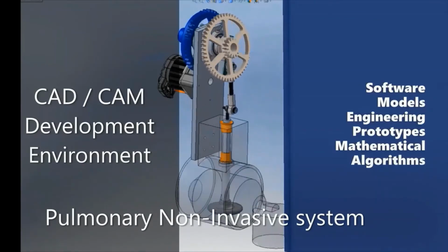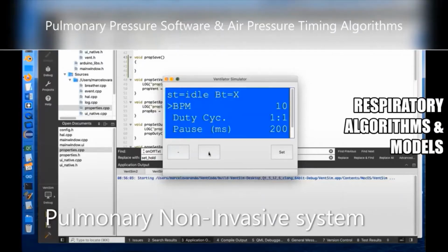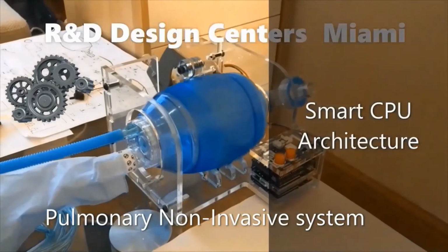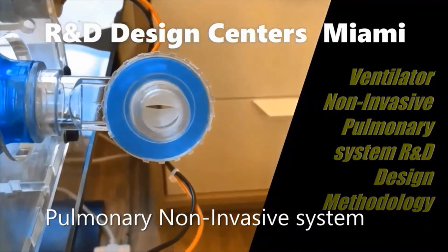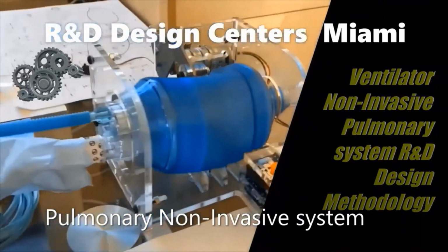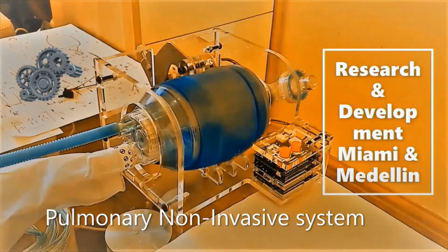The ventilator has a flow valve adjusting pressure to meet patient-specific parameters. When overpressure is released, the patient will exhale passively due to the lungs' elasticity. The exhausted air is released usually through a one-way valve within the patient circuit called the patient manifold.